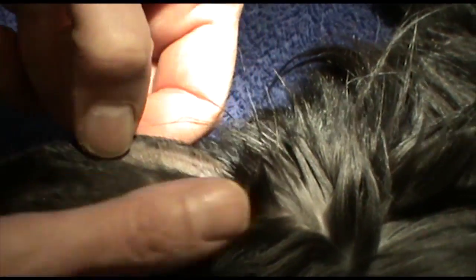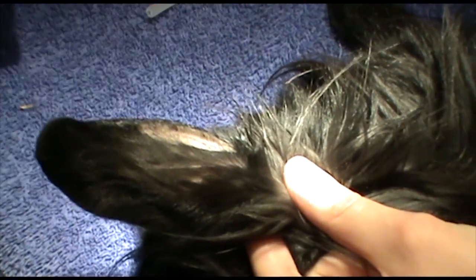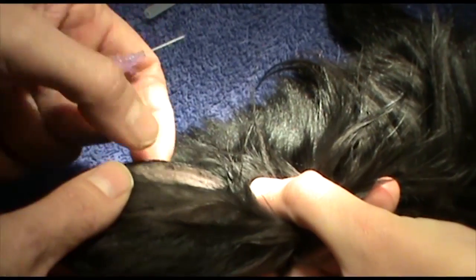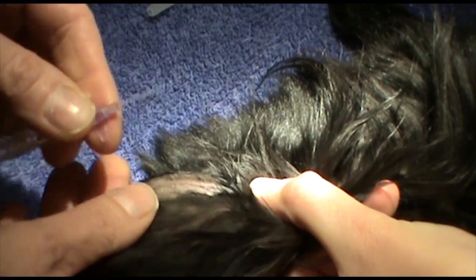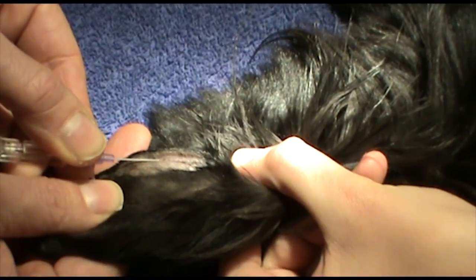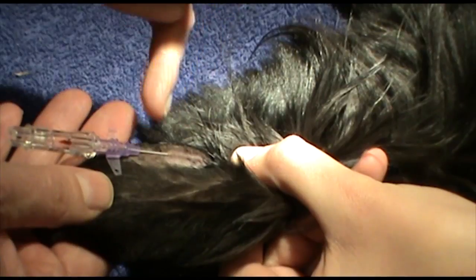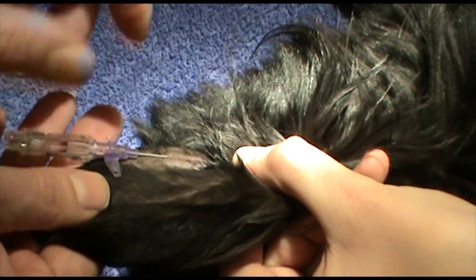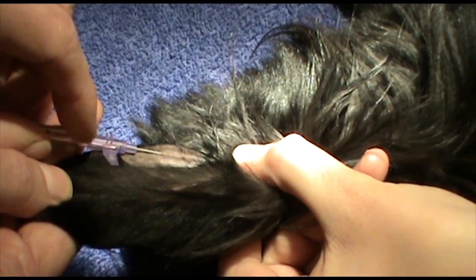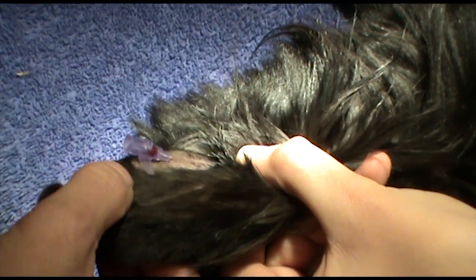This is the catheter we use. To raise the vein you just kind of pinch at the base of the ear. It's very similar to dog or cat technique — in the end of the day it's a very similar approach. You sometimes get vessels branching off which can make life more awkward, and the presence of an alpha-2 may make it more difficult. You're just sliding the catheter in, getting a little distance in. We've got some nice blood drawback here. We always use a winged 26-gauge catheter — otherwise you just struggle.